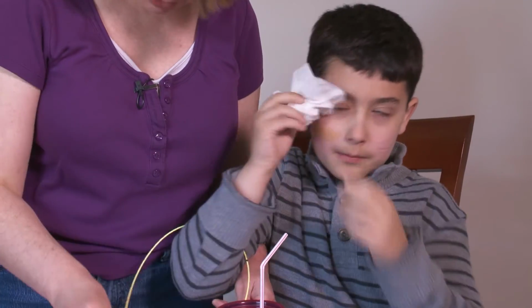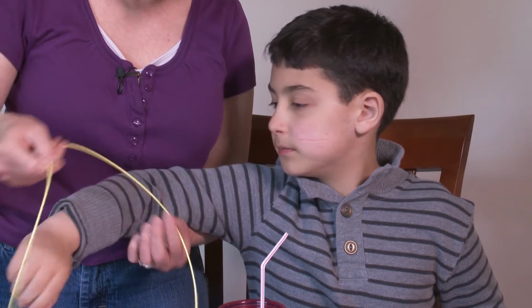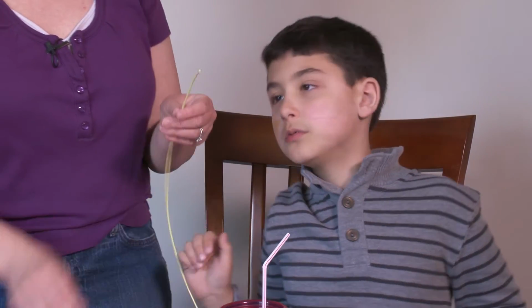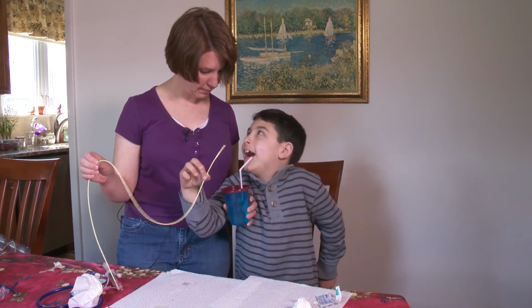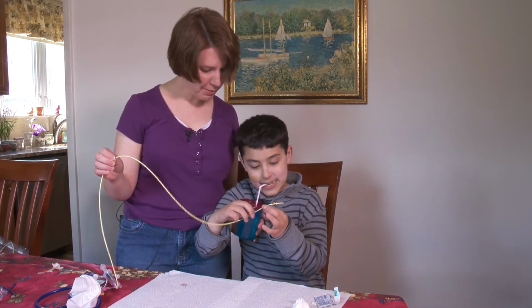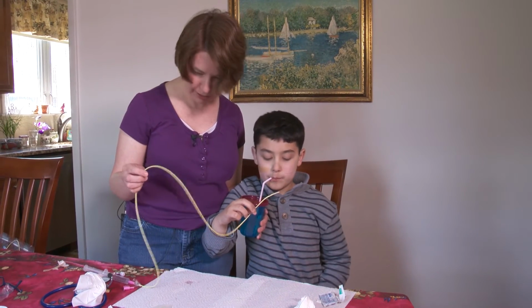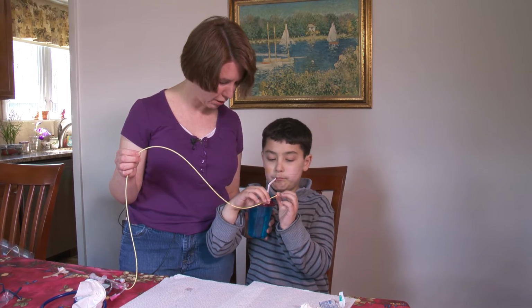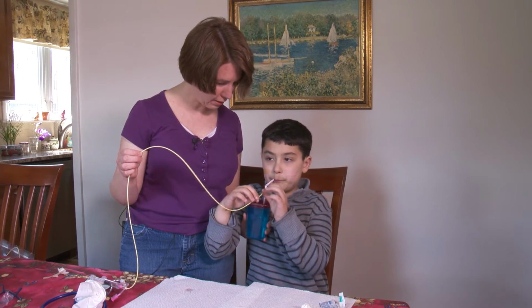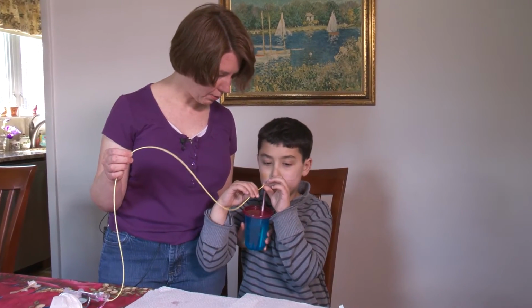Yeah, that happens. It happens a couple times sometimes, and that's okay. We're going to do it again. So now that I know that the nostril is clear for now. That's right. Sometimes Noah tries to do it, and there's like a booger in the way, and it can't get past it, and he has to really blow his nose. And sometimes we've even had to just go back to the other side of his nose, because the side feels blocked that day. So, yeah, you just got to work with what you got.